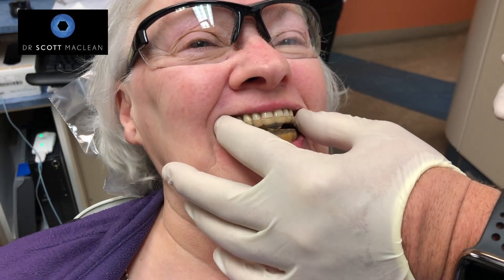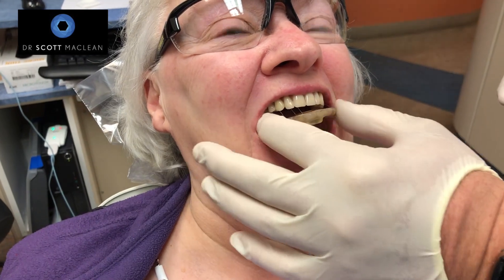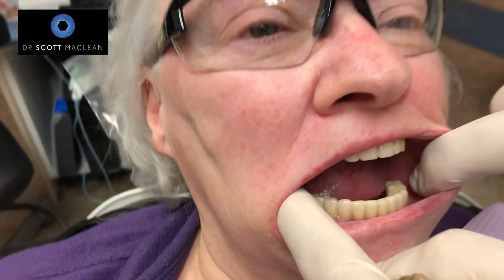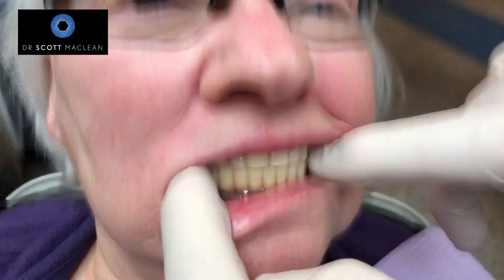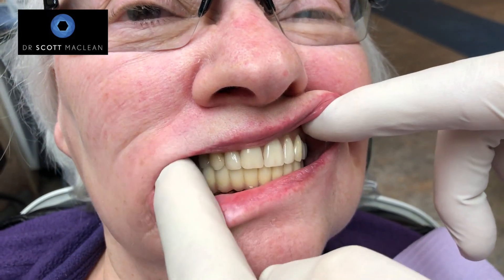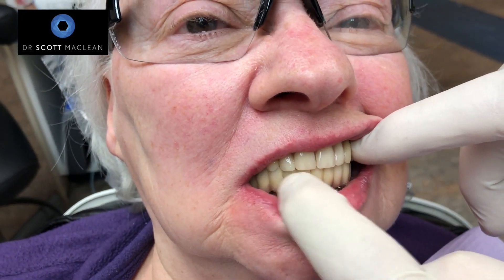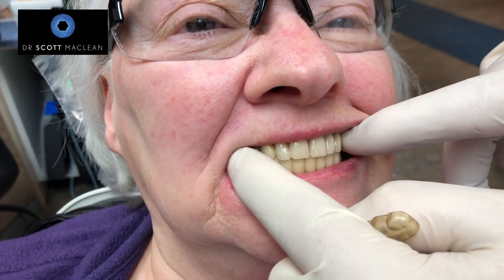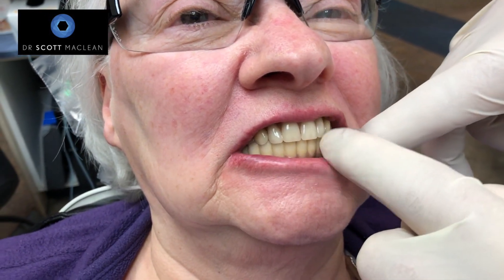Let's take these out. You can make this appliance on any bridge work or natural teeth — and this is something someone else invented, not me. You can see she bites together, she hasn't lost any vertical dimension of occlusion, which is good. She's biting porcelain against resin. I like that system so that we have an offset of forces — if she started to grind, we would be able to grind down the plastic or acrylic teeth. On the lower, those are not going to be ground down.